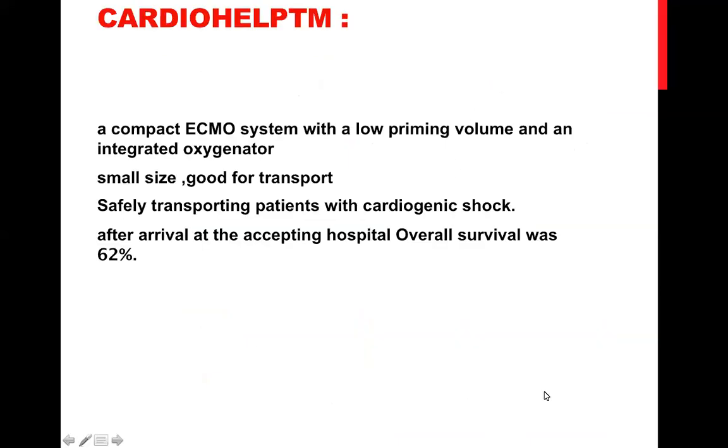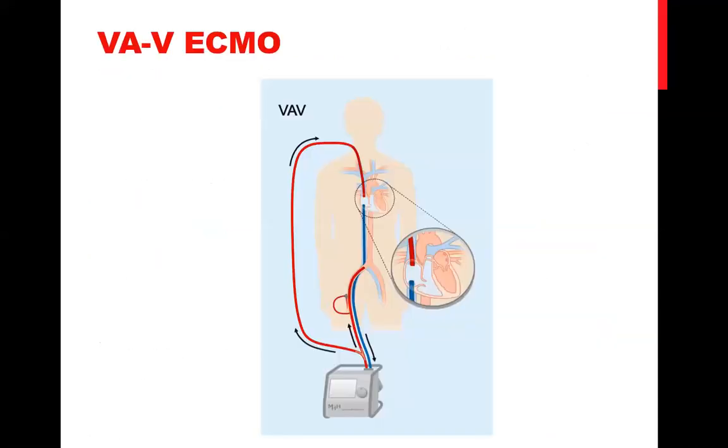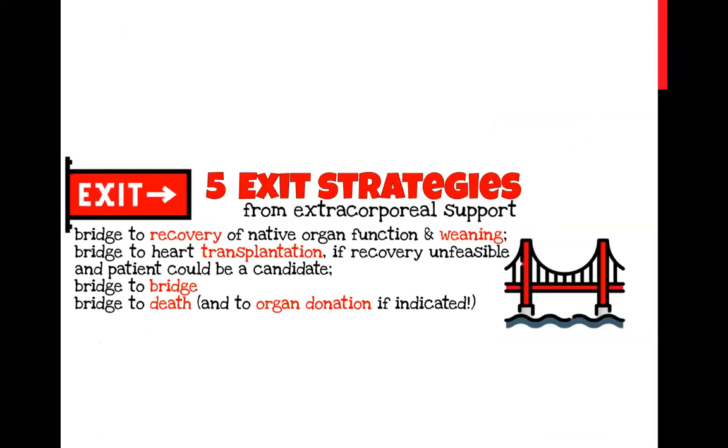Okay, newer devices. Just one thing I want to emphasize about one point you mentioned, which is exit strategy. As a cardiac surgeon, this is supposed to be in our mind when they refer a patient for ECMO, or even when we are facing post-cardiotomy syndrome: what is my exit strategy? Even if you are the one consulted, when you speak with your consultant and senior, you need to ask what the exit strategy and the prognosis are before proceeding with ECMO for any indication. This is very, very important.